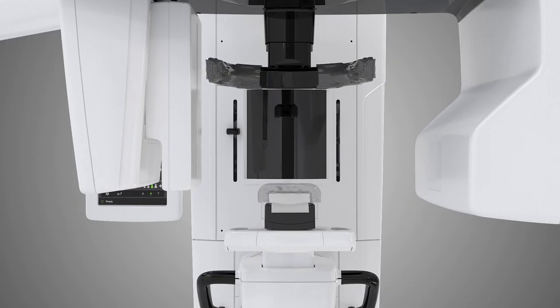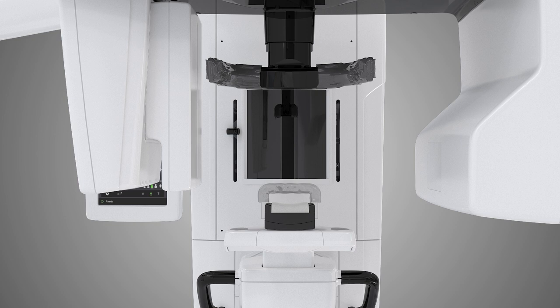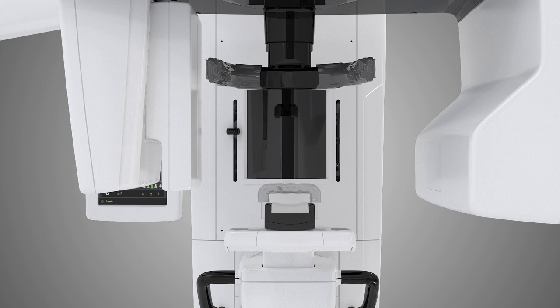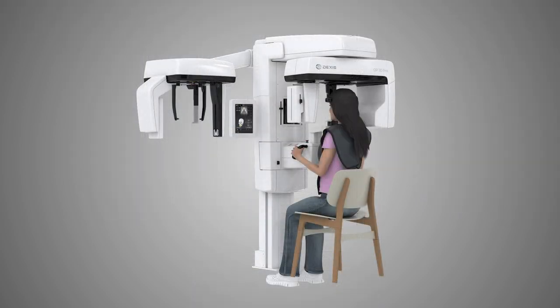The proper use of these positioning devices is critical for minimizing patient movement during 3D image acquisition. While this video will show image capture with the patient standing, depending on scan time and the patient's needs, you can also acquire the image with the patient in a seated position.